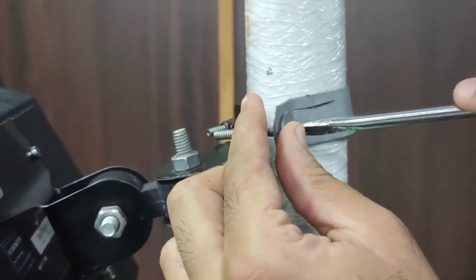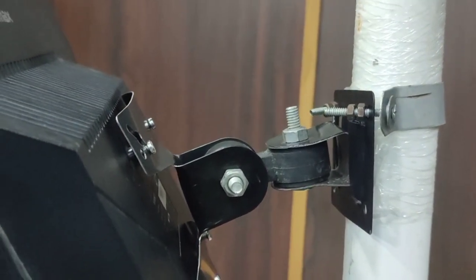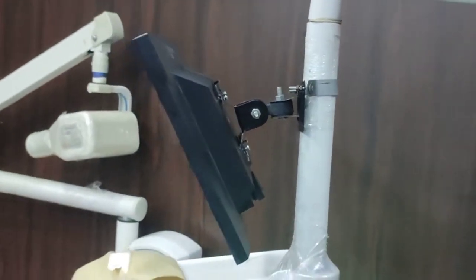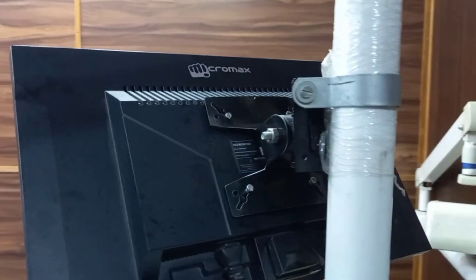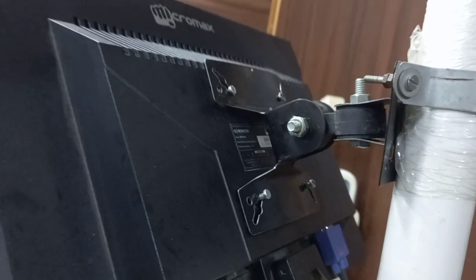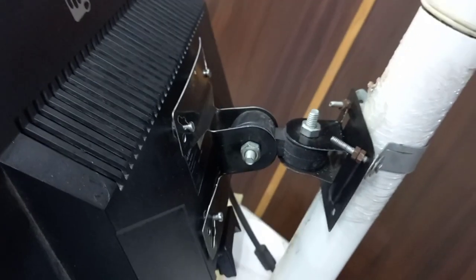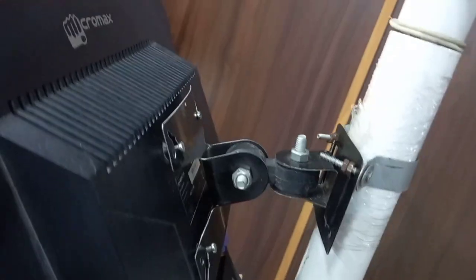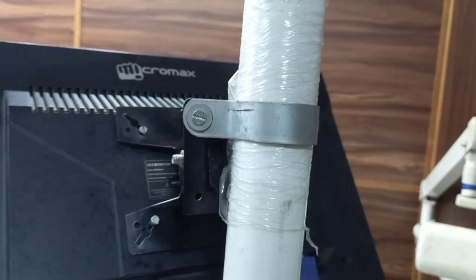Once you are assured, your assistant can step away and you can adjust the angles. As you can see, it is a very simple and easy process, and now our screen is connected to the pipe of our dental chair. For those who want to improve the aesthetic part, you can color your clamp and the whole wall mount in white. But when the screen is placed at an angle for easy viewing of the patient, these connections are generally not visible to the patient. This is the final look of our screen on the dental chair — any dental chair with an LED screen on it looks more advanced.